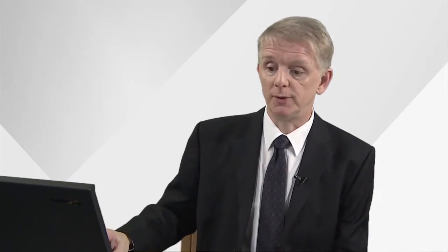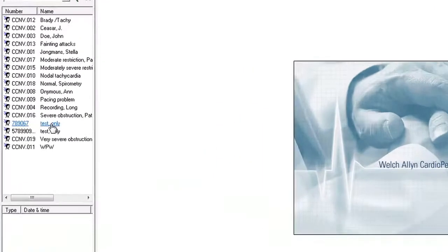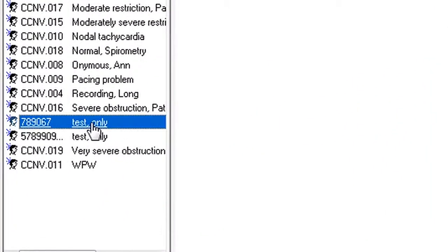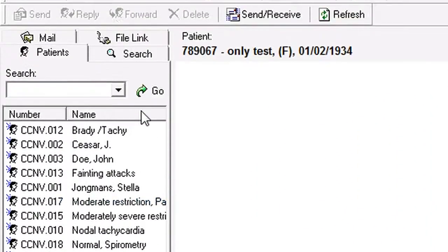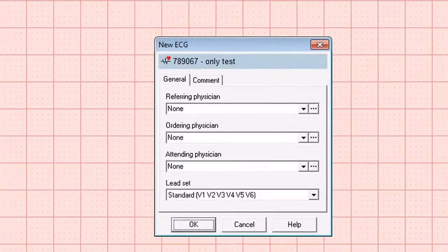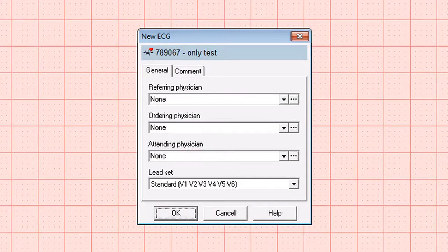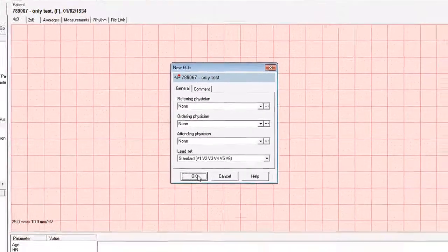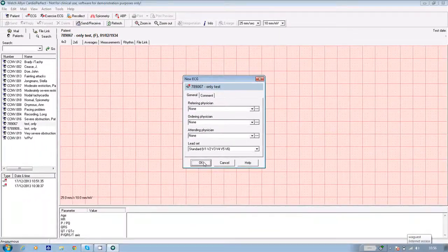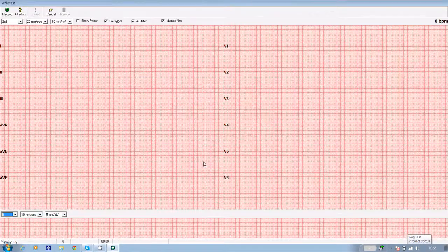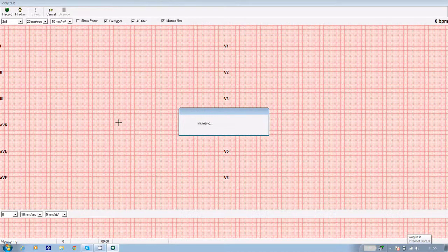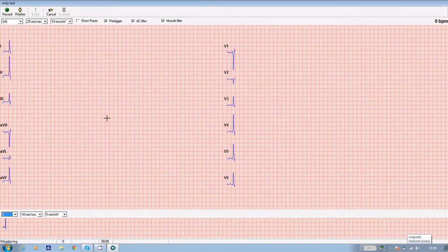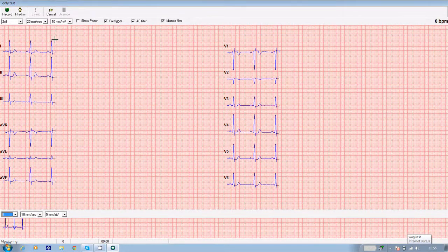But what if you want to take a longer ECG, a rhythm ECG? Well for this, you need to go back into the software and again either input or find your patient, highlight their name and again click on the ECG icon at the top of the screen. Again, you get a box which says new ECG and confirm by clicking OK if the patient's details are correct. Now once again, the traces appear on the screen in real time.